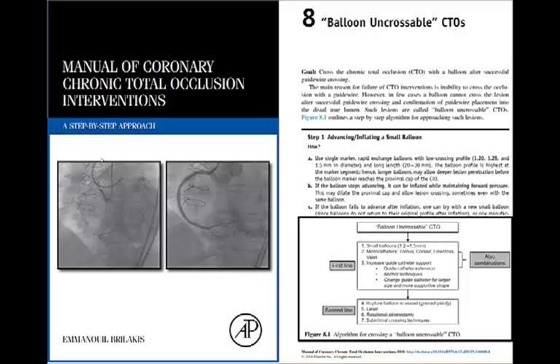And moreover, we recently published the manual of coronary CTOs that has a full chapter dedicated to how to approach the balloon uncrossable lesions. Thank you.